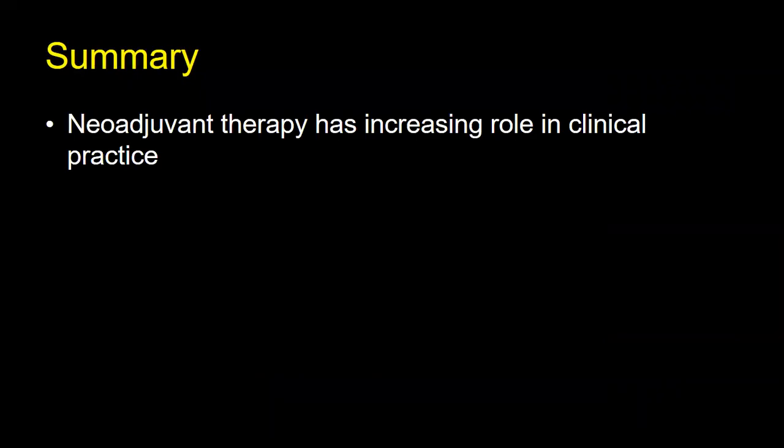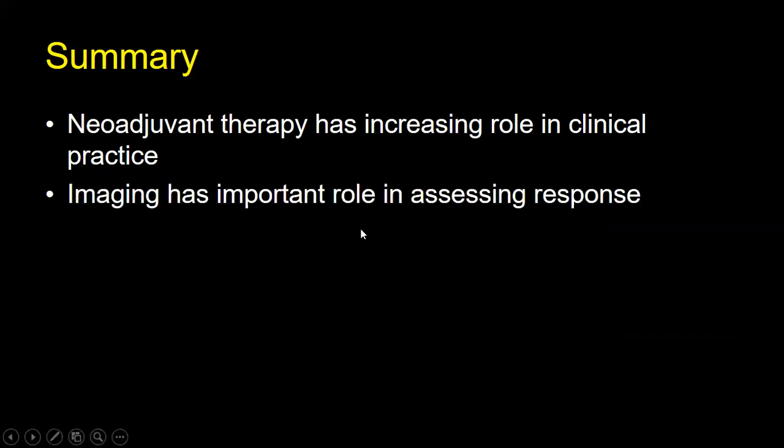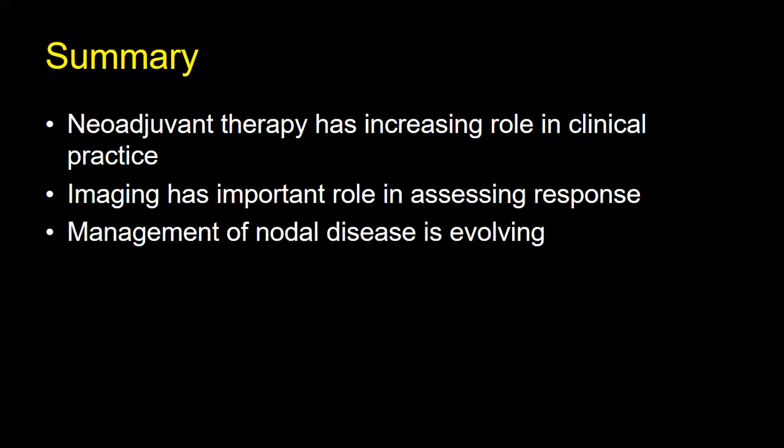In summary, neoadjuvant therapy has an increasing role in clinical practice, increasingly administered, particularly for certain subtypes that are biologically aggressive. Imaging has an important role in assessing response, MR being the most accurate, but ultrasound and mammography also have their role. Management of nodal disease is evolving.